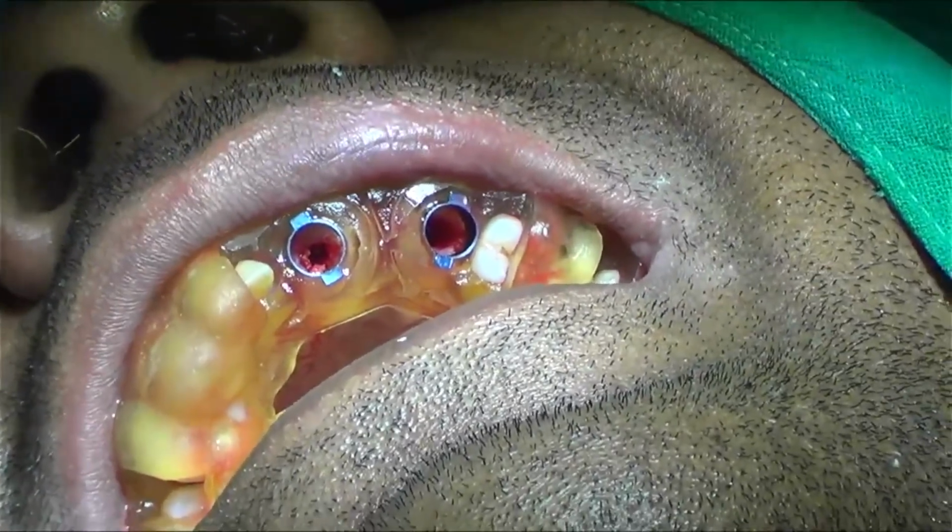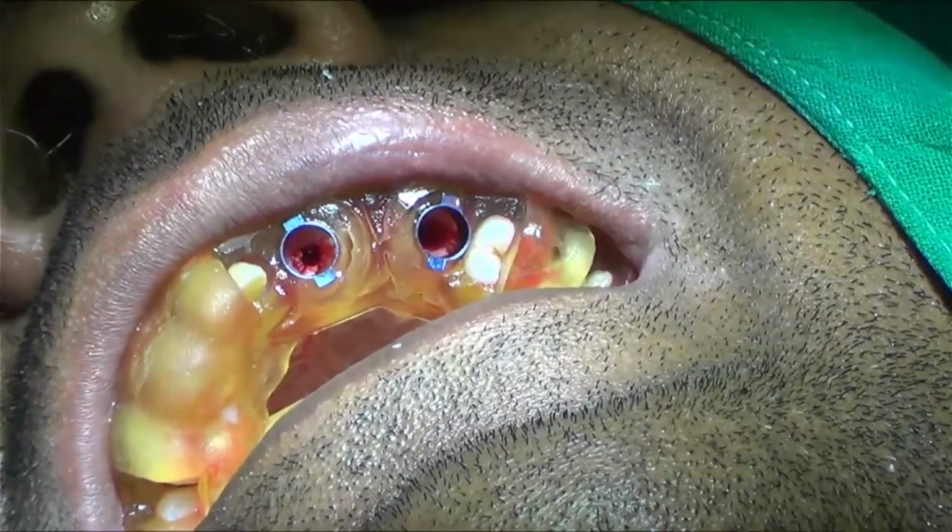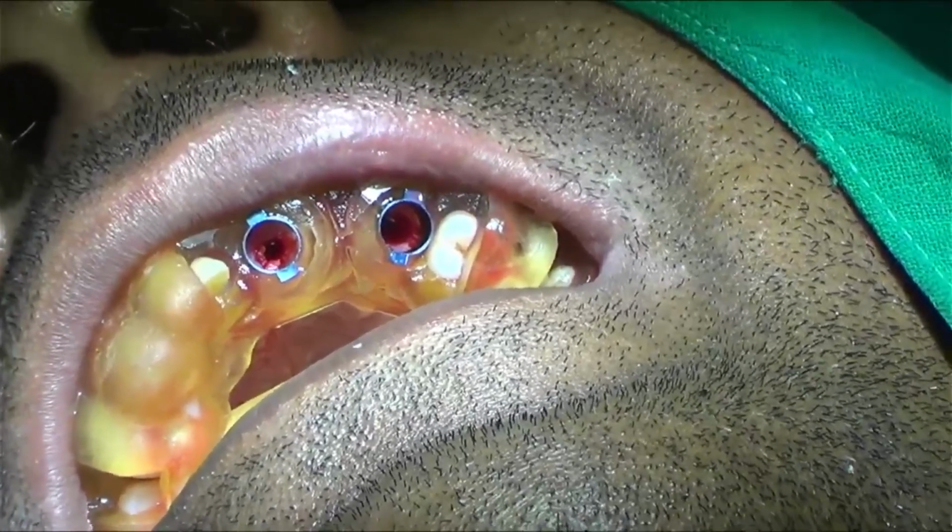It will go in that direction only, in which we have basically prepared an osteotomy.